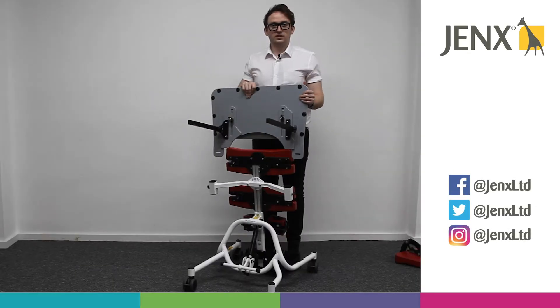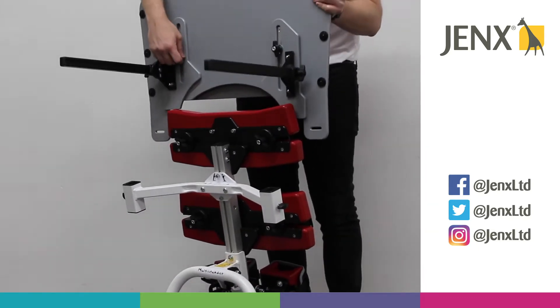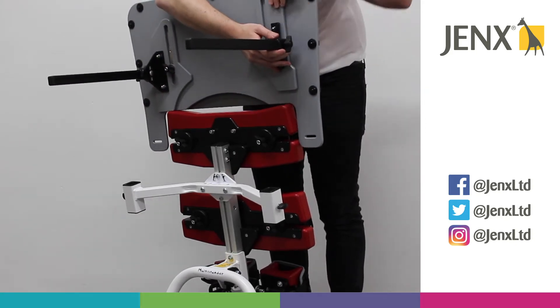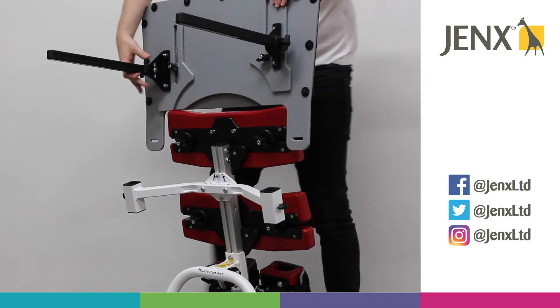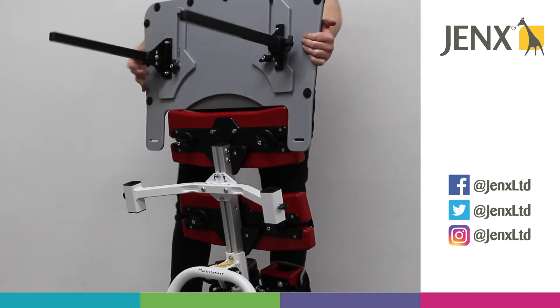Putting the tray into a prone position, the first thing we need to do is ensure that the fittings for the tray arms are in the right position. We need them right at the bottom, and what that will do is bring the tray in as close to the frame as possible.